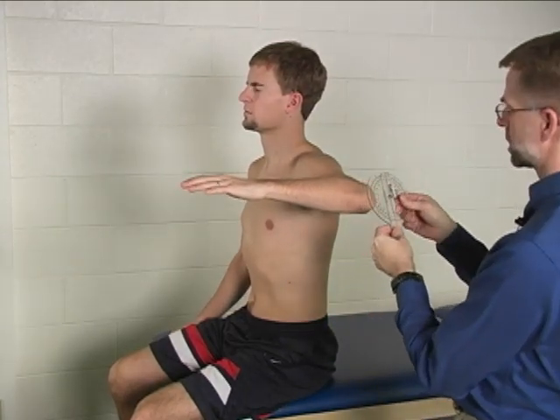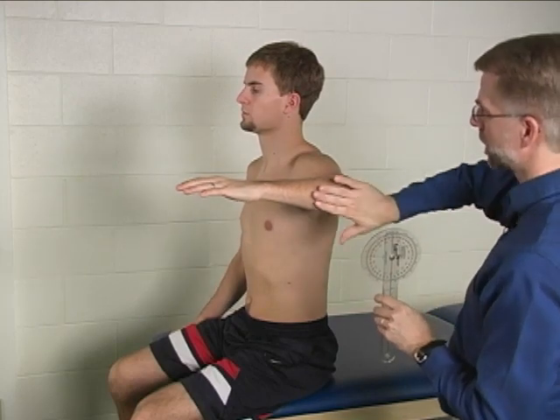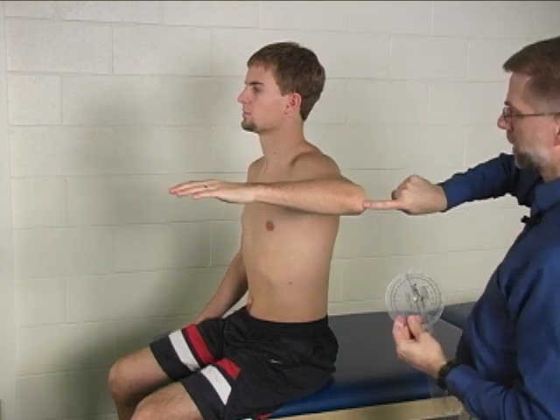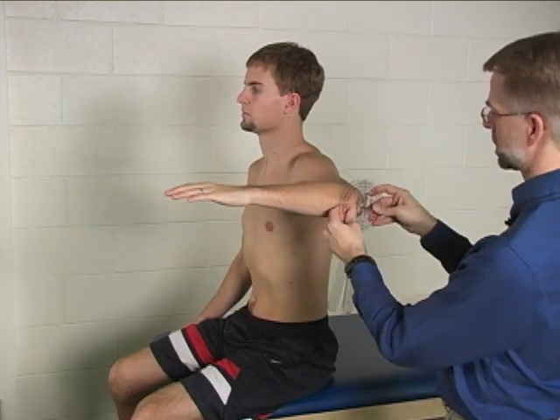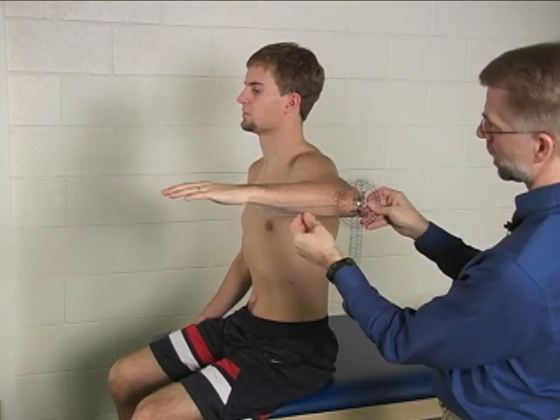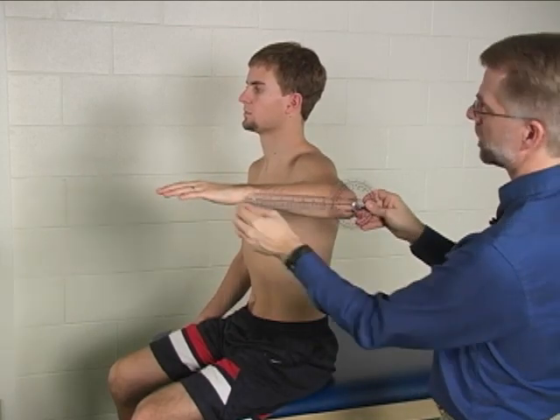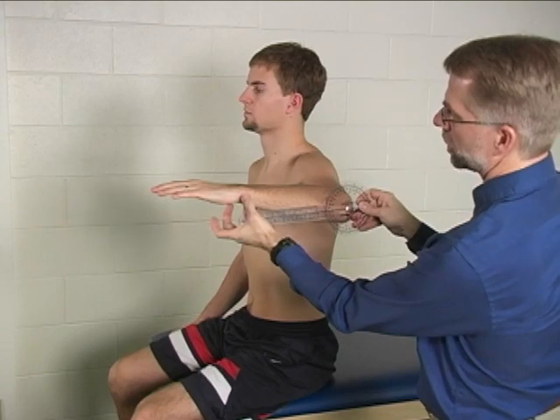The goniometer is placed on the posterior ulnar forearm. The axis of the goniometer is lined up with the olecranon process, the stationary arm is held horizontal, and the moving arm is in line with the ulnar styloid.